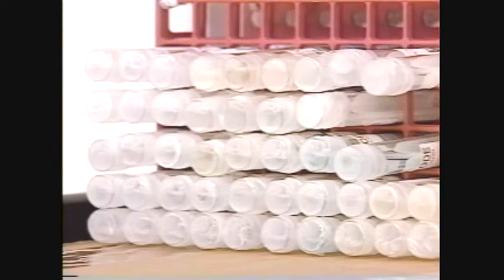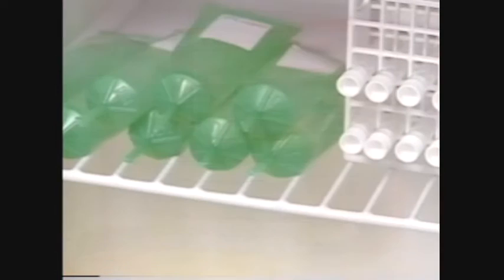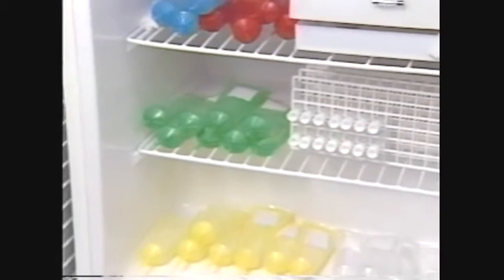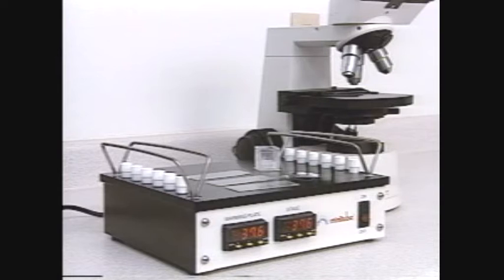A sample of each extended ejaculate or pool should be maintained for quality assessment the day following collection, and then periodically during the routine storage period. One AI dose can be used for this purpose. Or after routine cooling, the semen from one dose can be aliquoted into pre-cooled, small, disposable culture tubes. One culture tube is used each day for the evaluation and then discarded.